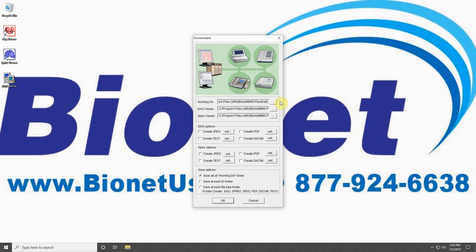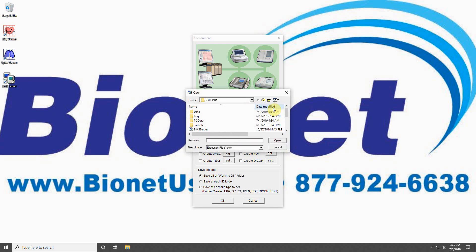Defining these file locations will allow you to launch the programs from your BMS Server system tray icon. Click three dots next to each and a window will pop up to define file locations.